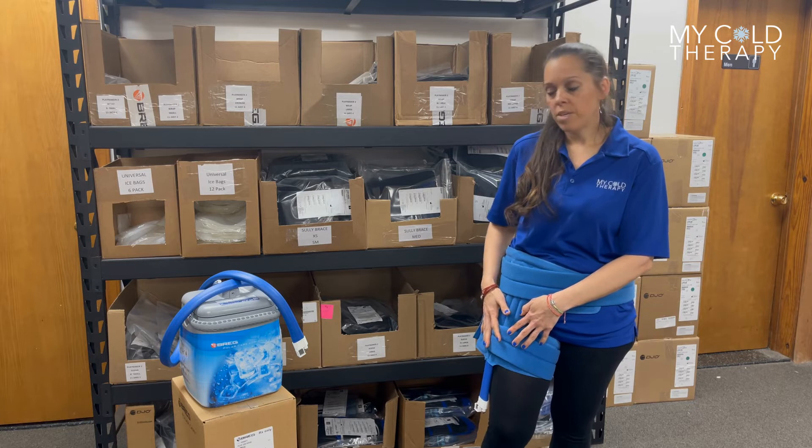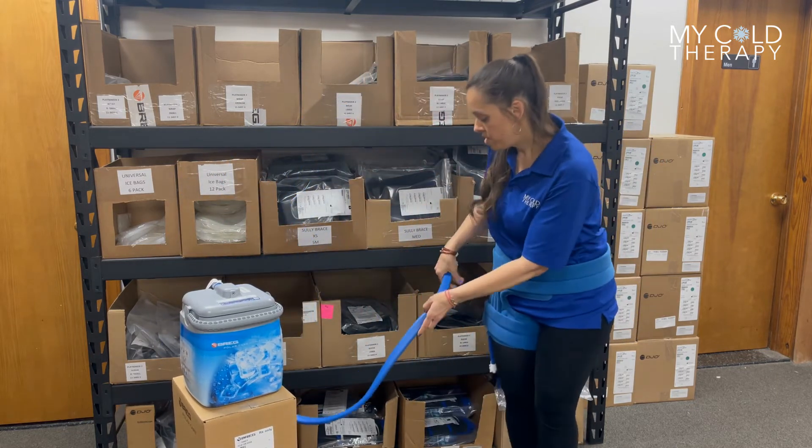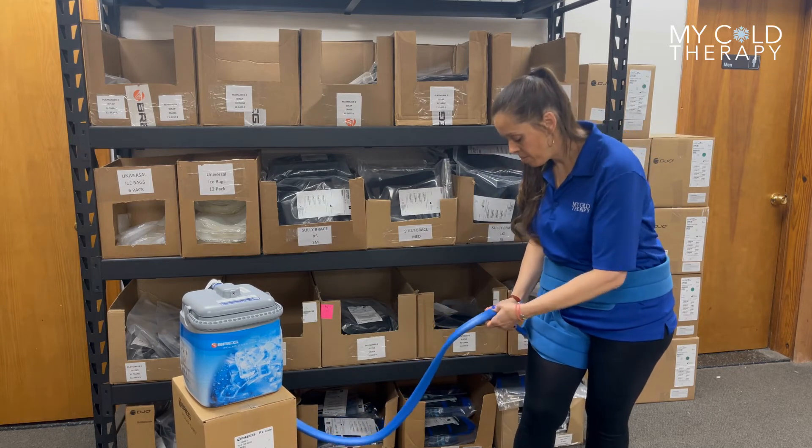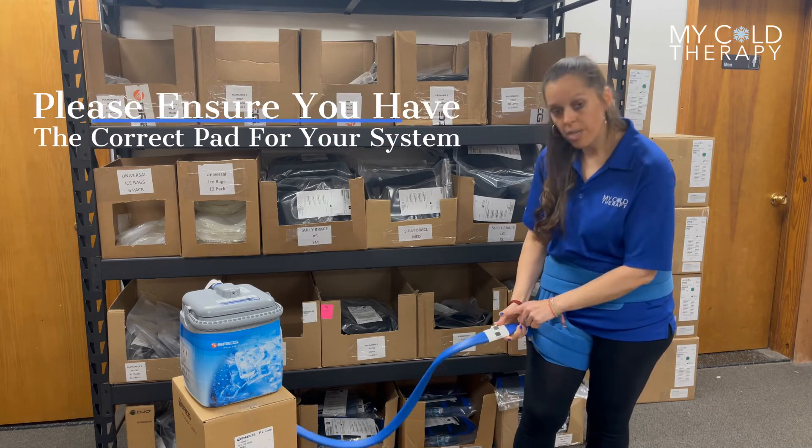Once you have it firmly in place, you're ready to connect to your system. As you can see, there's a pretty good hose length on these systems. Put them together, they click into place, and you're ready to go.